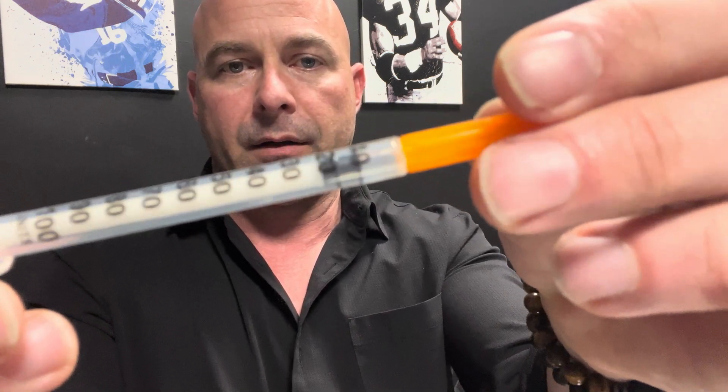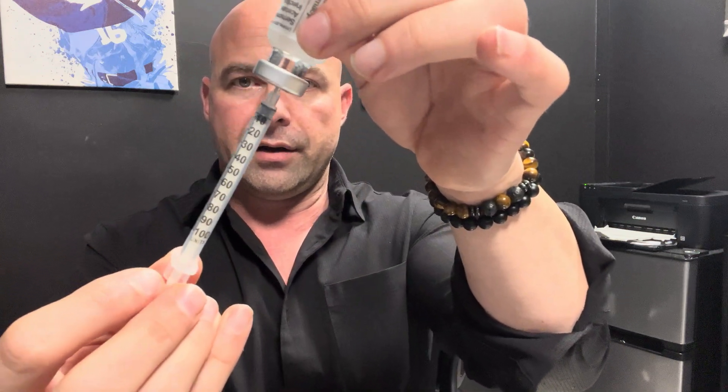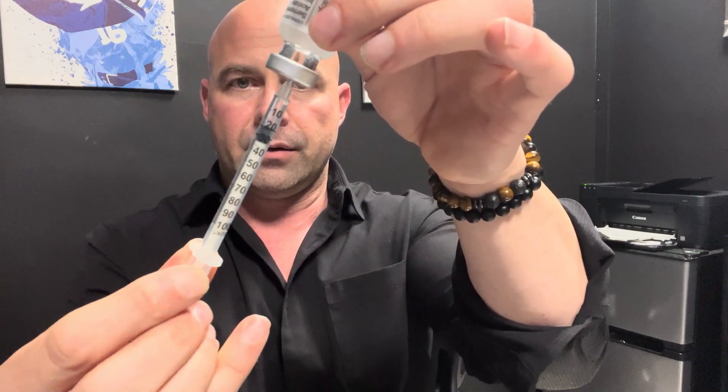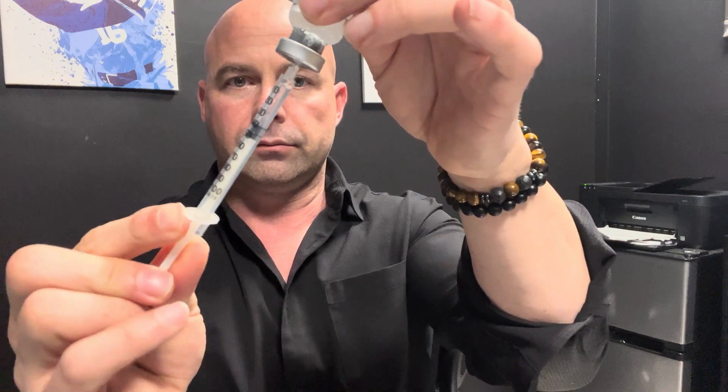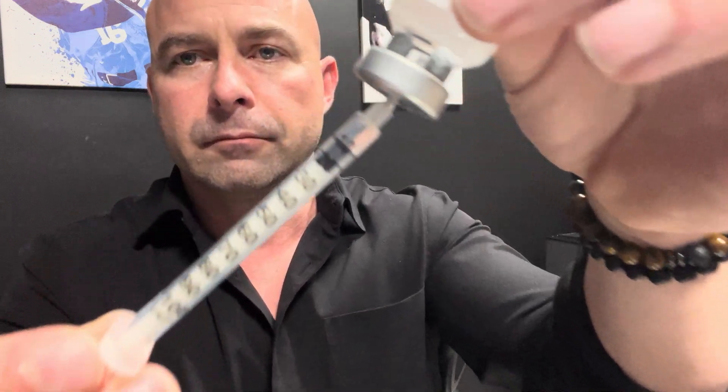The dose for this is going to be 10 units. I'm going to go ahead and get the bottle — turn it upside down, and look, it just pulls the syringe right out. Then we pull it back to get our dose. Okay, we got to the 10.